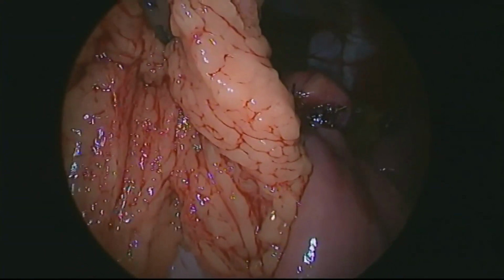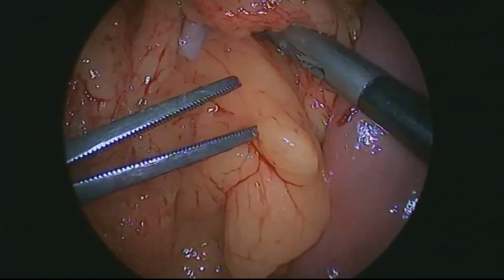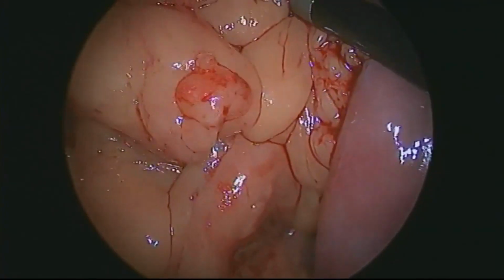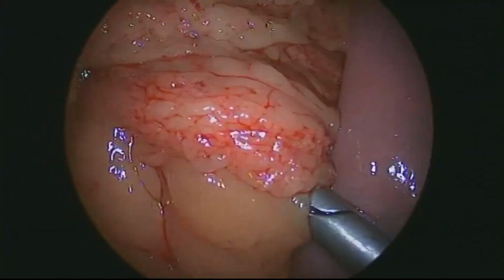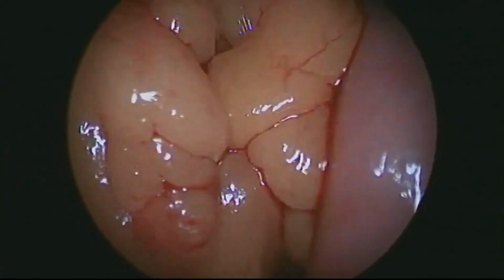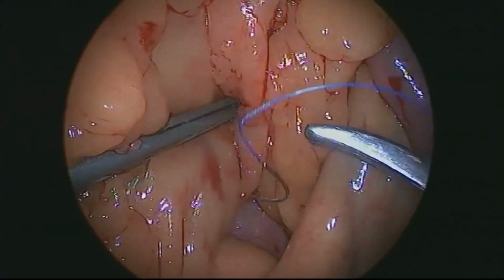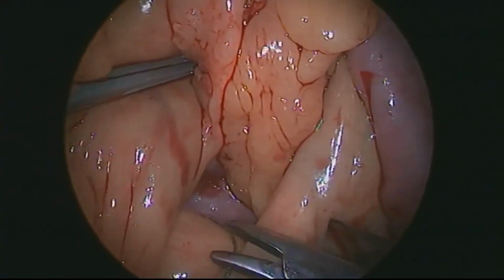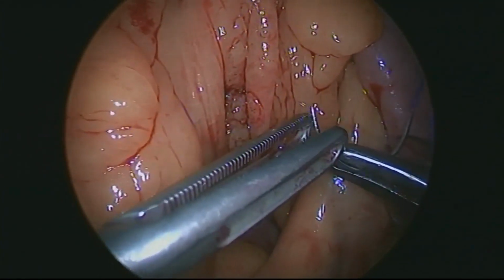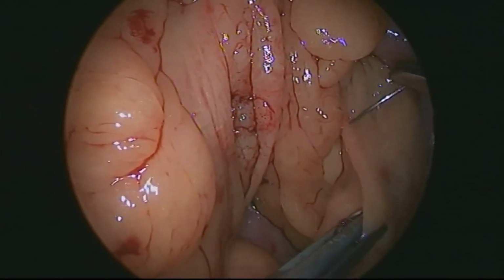We start by locating the efferent limb that you see here to the right of your screen. We locate the transverse colon and the omentum attached to it. We lift all this cranially, which opens up Peterson's defect and which, in the depth, will reveal the angle of Treitz. So now we're ready to perform the closure itself.